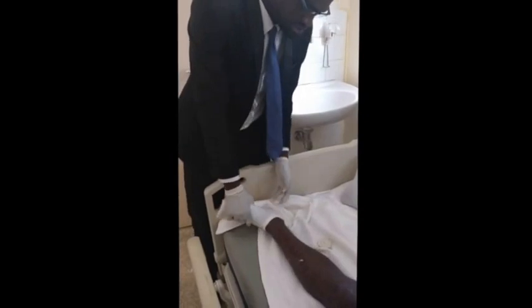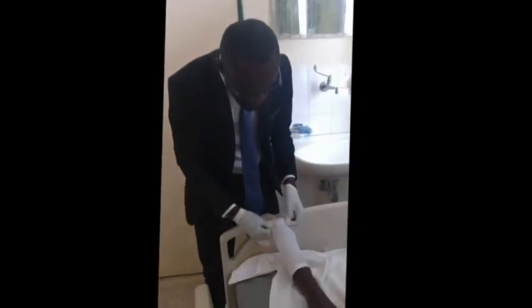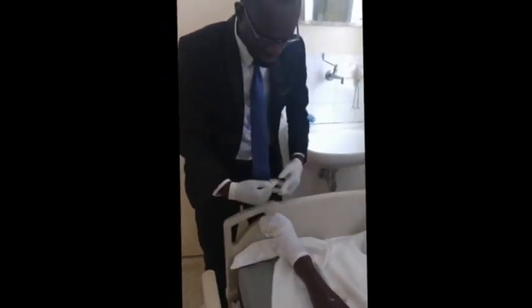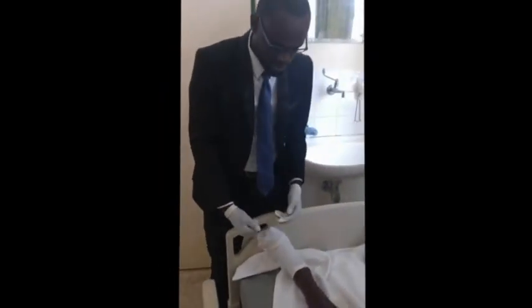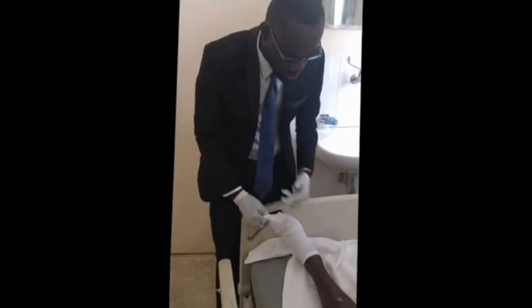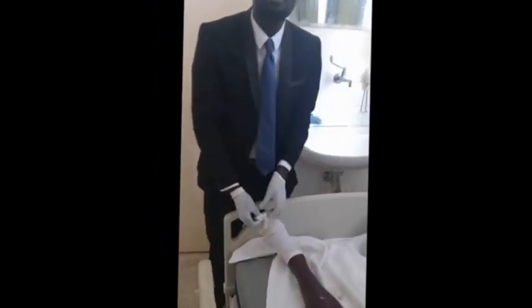I do this, now my heel is within the heel pocket. So that's the first thing I need to make sure. Then I run the turned part of the stockings over the toe, over the ankle, along the calf, up to the appropriate position.